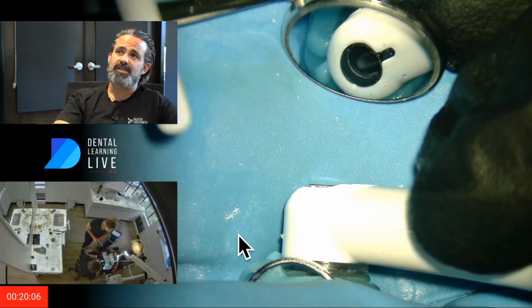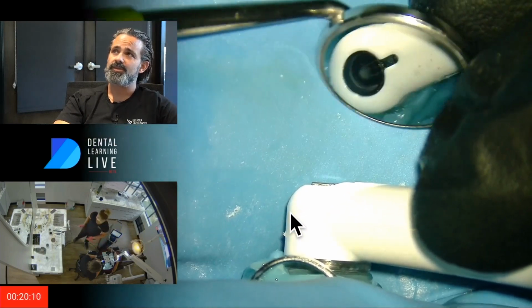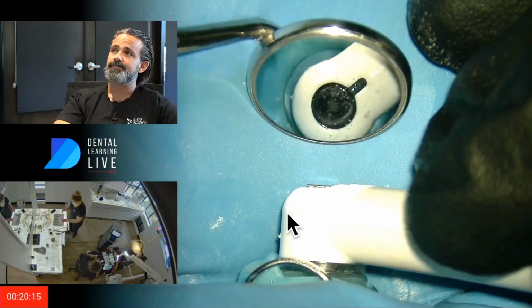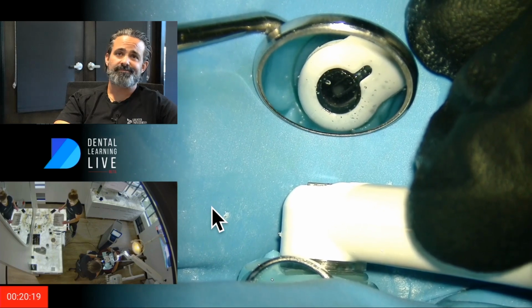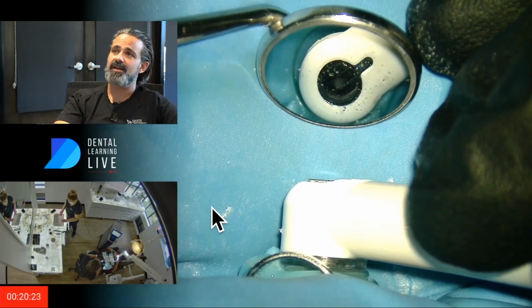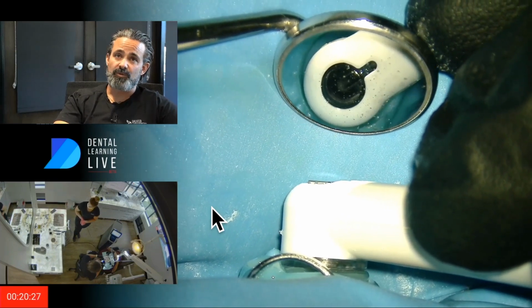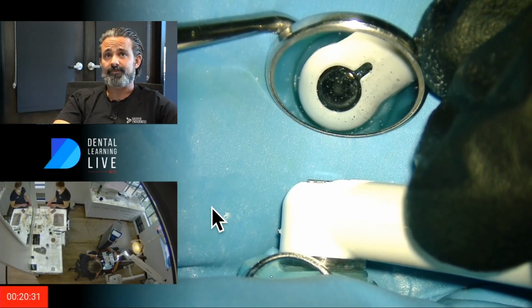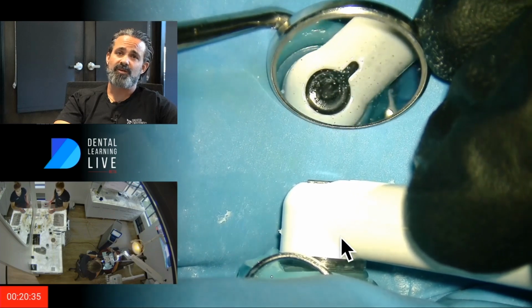You could also use this time to get up and walk out, do a consult check if you had that in your schedule. And a lot of times that's what's happening to me. But again, I've found other workarounds for the consults. I tend to do them during anesthetic now instead of during the quote-unquote working length, because I'm not doing working lengths the same. But if I do a working length, I will also do a consult then, and that keeps my butt in the chair during the GentleWave procedure.